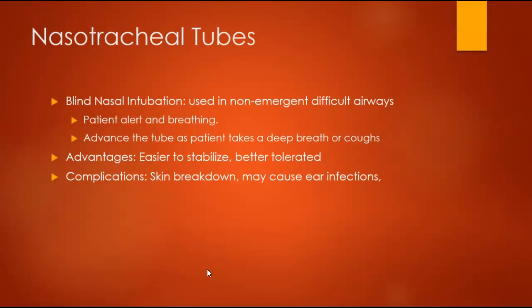That can be very difficult in somebody who has a known difficult airway, like somebody with a high Mallampati score or high BMI, or any other facial anomalies that may make us think it would be difficult to intubate. So an advantage of these is they're usually easier to stabilize than oral tubes, and typically better tolerated. It's going to be a lot more secure in the nose than in the mouth.